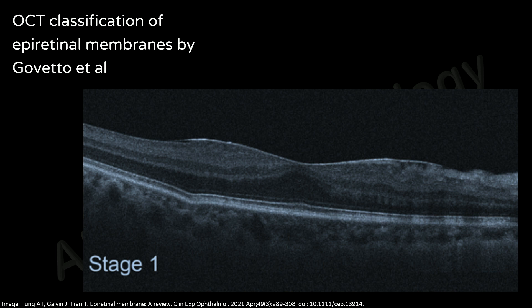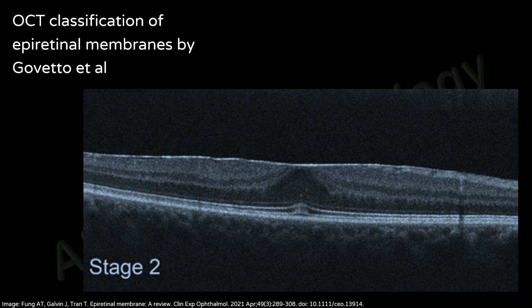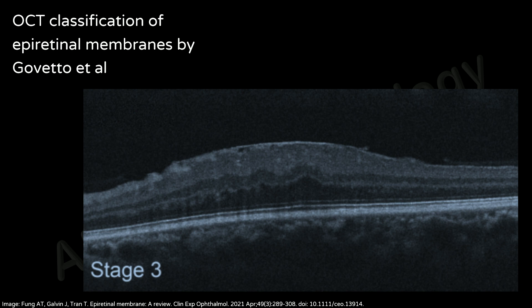Stage two is defined as the presence of ERMs associated with more progressive retinal distortion. The foveal depression is lost and a characteristic stretching of the outer nuclear layer is present. All retinal layers are defined and clearly identified with OCT.